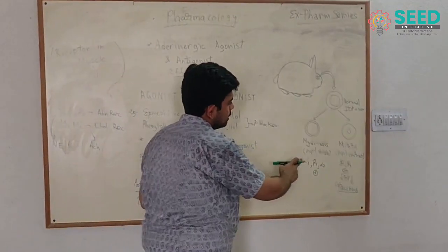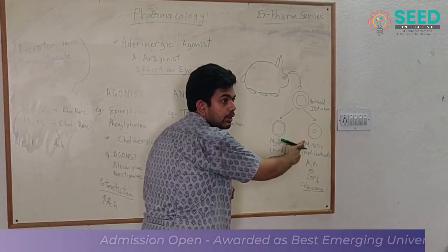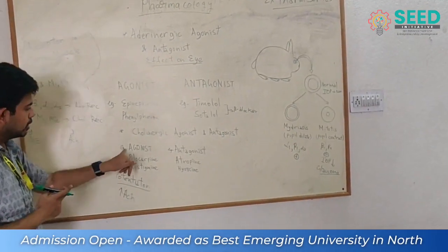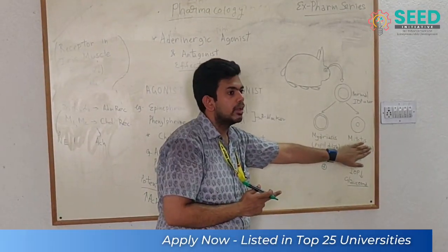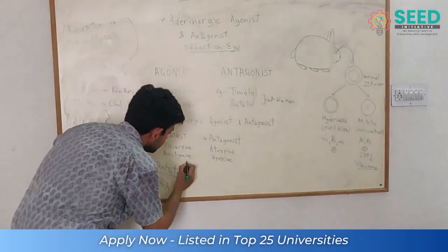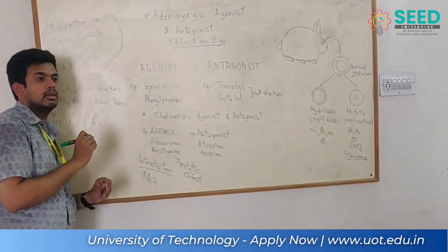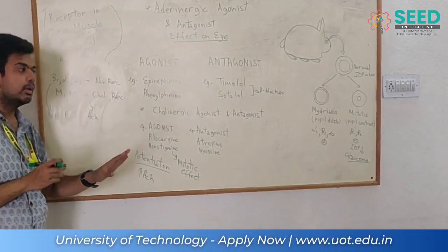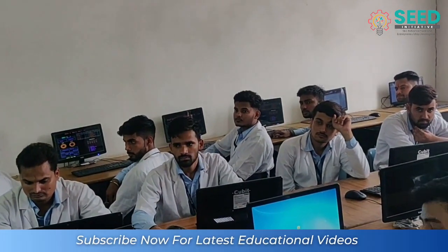Okay. You can see here that adrenergic agonist gave you a mydriatic effect and adrenergic antagonist gave you a miotic effect. Cholinergic agonist and cholinergic antagonist will give you just the opposite effect of this. So if I am giving pilocarpine or neostigmine, it won't have a mydriatic effect, it will have a miotic effect. It is only due to increased potentiation of your acetylcholine. So I will write here that it will give a miotic effect. Miotic means the constriction of your pupils. Neostigmine and pilocarpine are usually also given for your glaucoma. This timolol and this pilocarpine come in a fixed dose combination of eye drops.